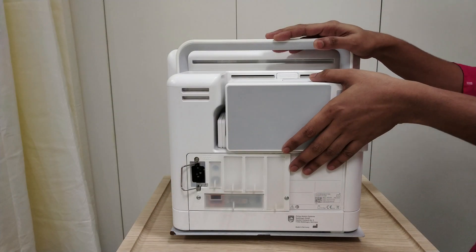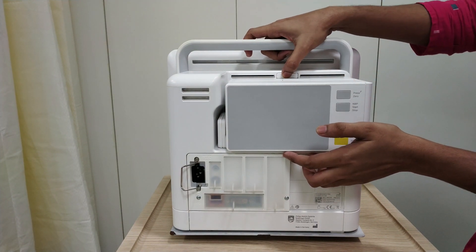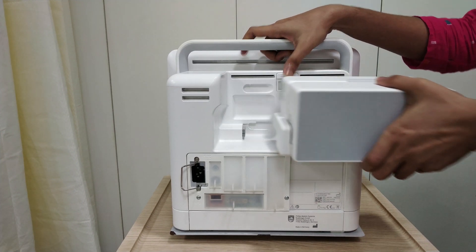Now, removing this server — you have to hold the server like this to avoid damage. You can see one button here. Hold, press, and in.